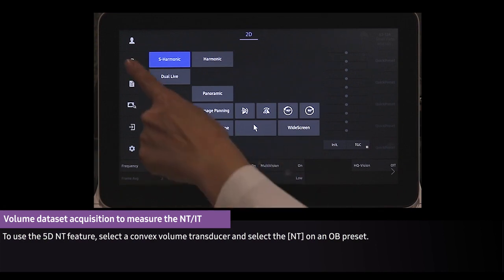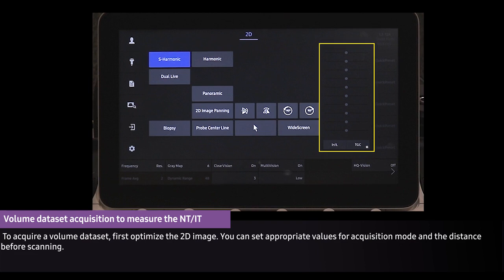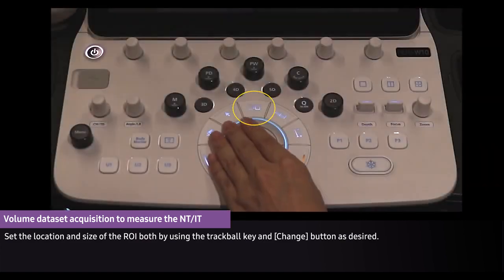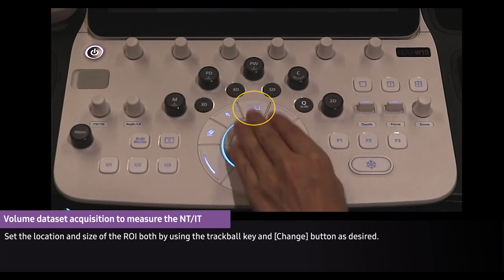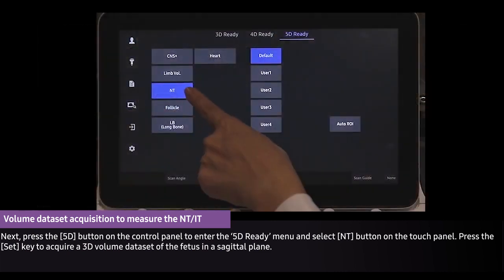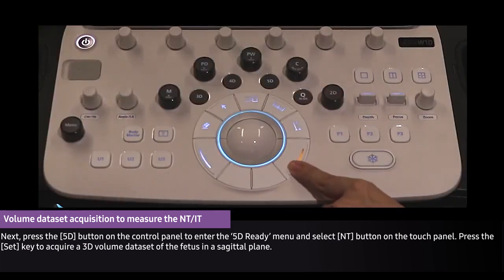To use the 5D NT feature, select the convex volume transducer and select the NT on an OB preset. To acquire a volume dataset, first optimize the 2D image. You can set appropriate values for acquisition mode and the distance before scanning. Set the location and size of the ROI both by using the trackball key and change button as desired. Next, press the 5D button on the control panel to enter the 5D Ready menu and select NT button on the touch panel. Press the Set key to acquire a 3D volume dataset of the fetus in a sagittal plane.